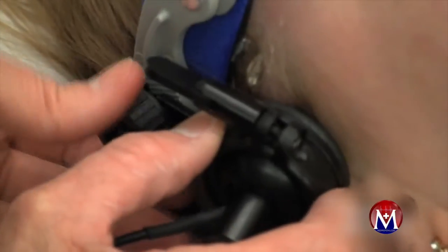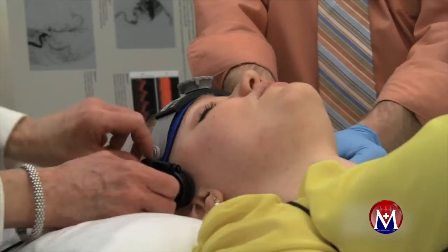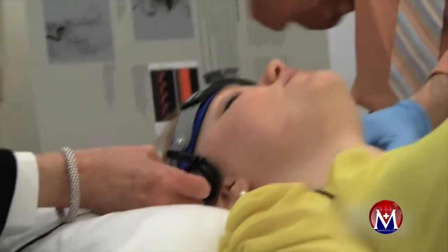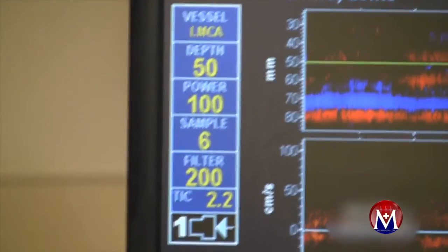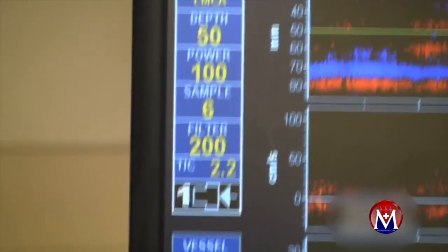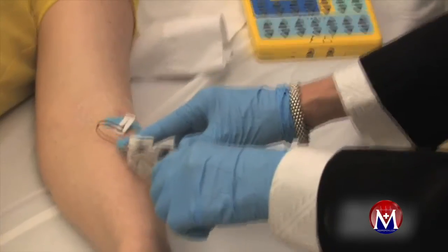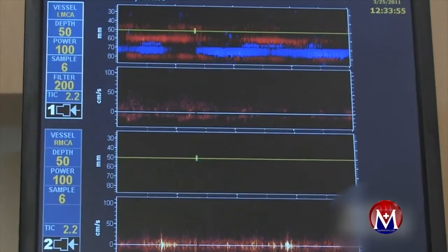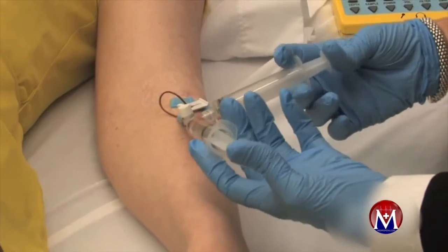Making this a little tighter, we're going to go ahead and find our windows. You want to monitor the MCA and ACA primarily because that's where the majority of the blood flow goes — you'd get more air bubbles going through those vessels as opposed to the PCA. This will be the resting injection.